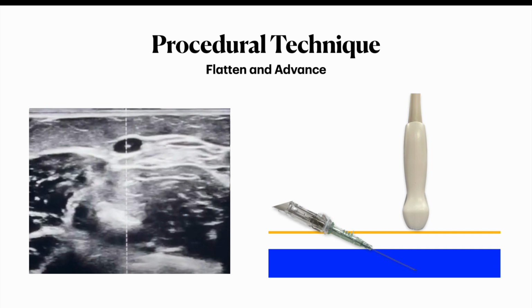I will also note that once you have your flash and you flatten and advance the needle, the needle tip and point, which is the most painful aspect of IV insertion, is within the blood vessel. There are no pain sensory nerves inside of the blood vessel itself, so this portion of the procedure is relatively more comfortable for the patient than the initial IV insertion.